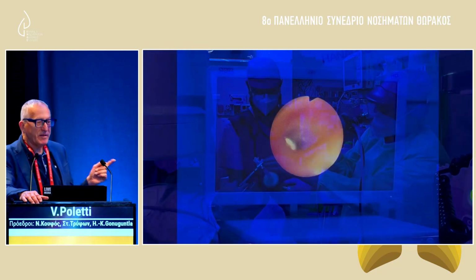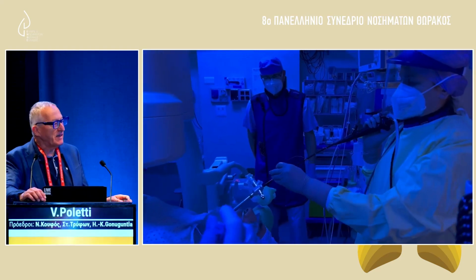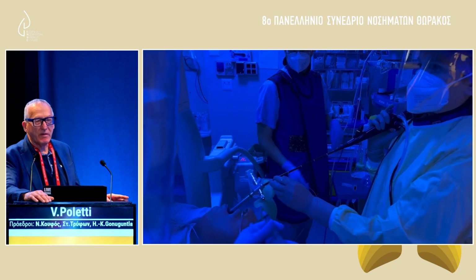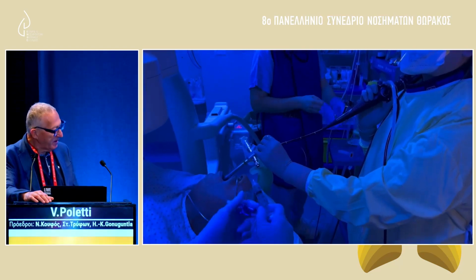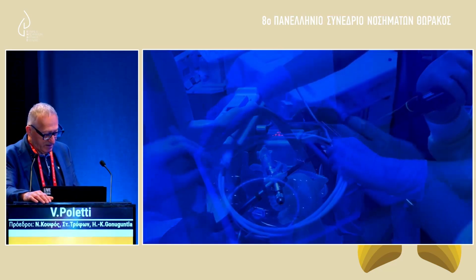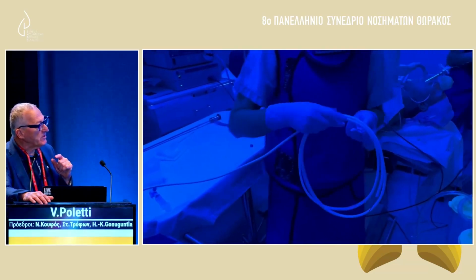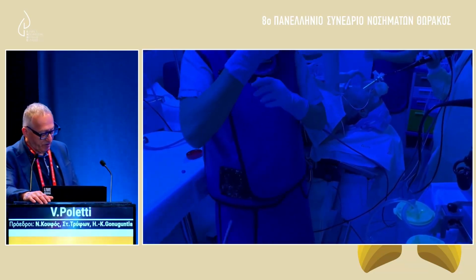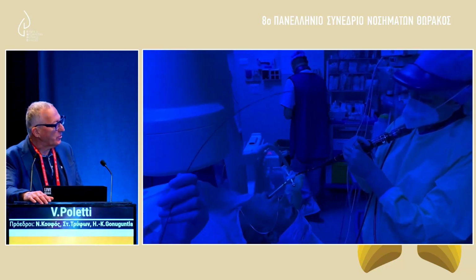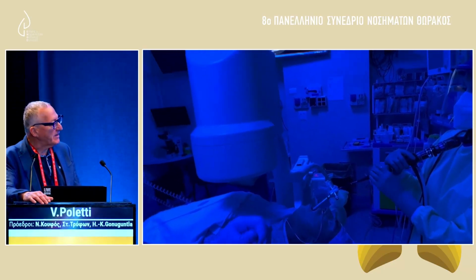And the patient is, of course, under general anesthesia, but maintains his or her spontaneous breathing. We don't use muscle relaxant. And here, usually we use the 1.7 cryoprobe, but sometimes the 2.4, and in specific contexts, the 1.1. And the guidance is provided by fluoroscopy.